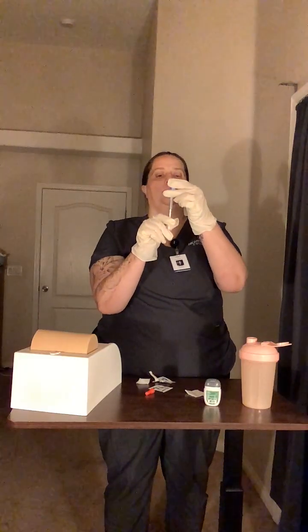So I can put that much air into it, and I'm going to take off the lid. The vial, pushing all that air in there, going ahead and pulling out the 1 milliliter.